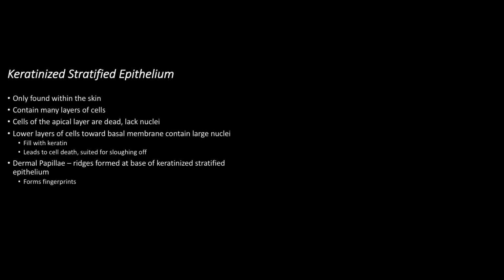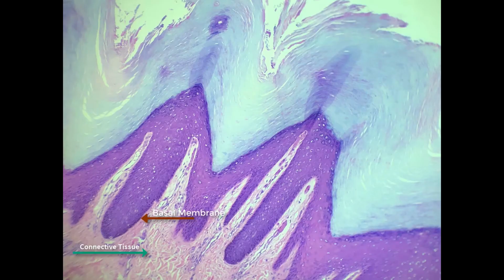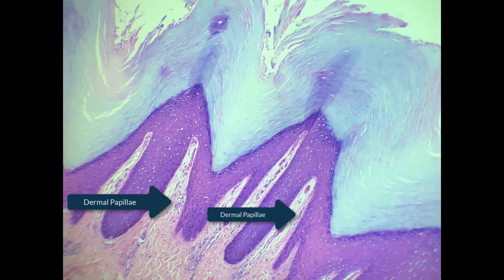An interesting thing about keratinized tissue is the basal layer often follows a more wavy shape that is formed by the areolar connective tissue it sits upon. In non-keratinized stratified squamous epithelium, the waviness is less pronounced in some organs, but in keratinized stratified squamous epithelium, and particularly thick skin, it can be very pronounced. It is these wavy ridges, called dermal papillae, that form our fingerprints.